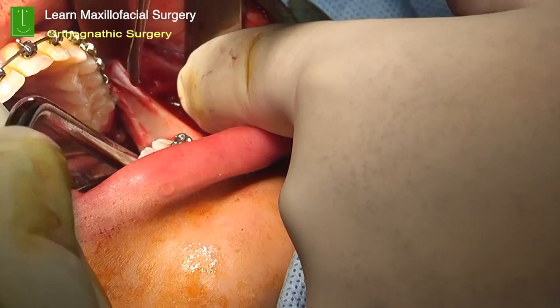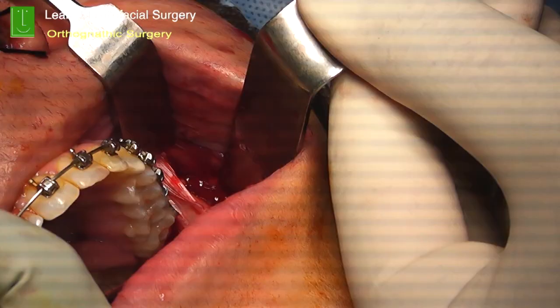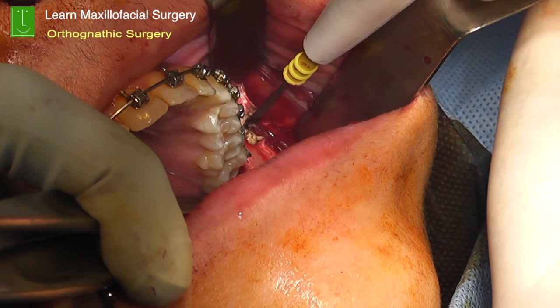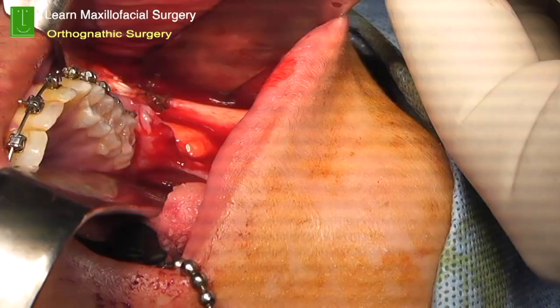Identifying the lingula is very, very important, because the lingual cut has to be just above the lingula, so thereby you're basically protecting the inferior alveolar nerve. So very, very gently retract the tissues. Here the temporalis basically gets attached to the anterior border of the ramus of the mandible. Using cautery or basically a knife, you can dissect the temporalis out so that you can get very good visualization onto the lingual aspect of the ramus of the mandible.